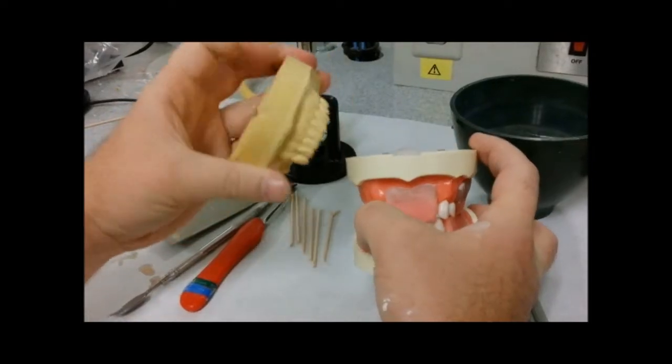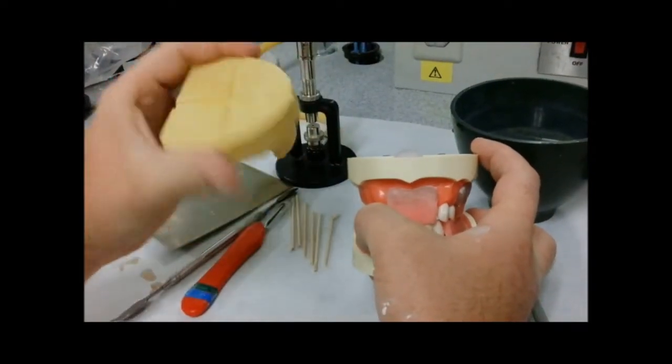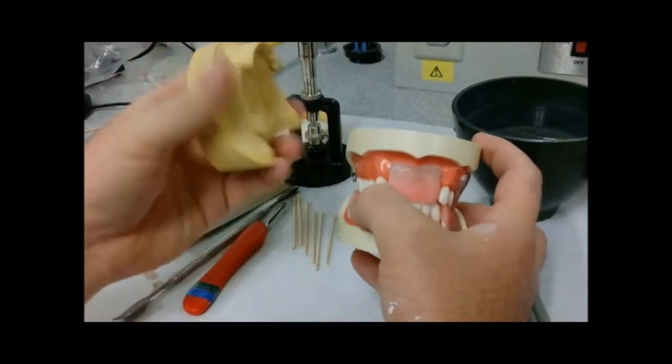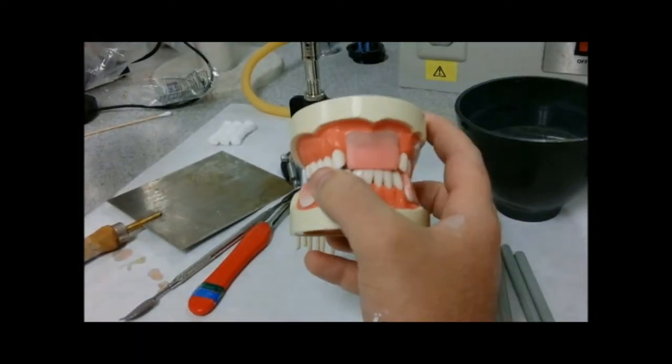You should have your mandibular, it's unmounted so that's what we're doing today. We're going to make the occlusion rims and be able to mount these.